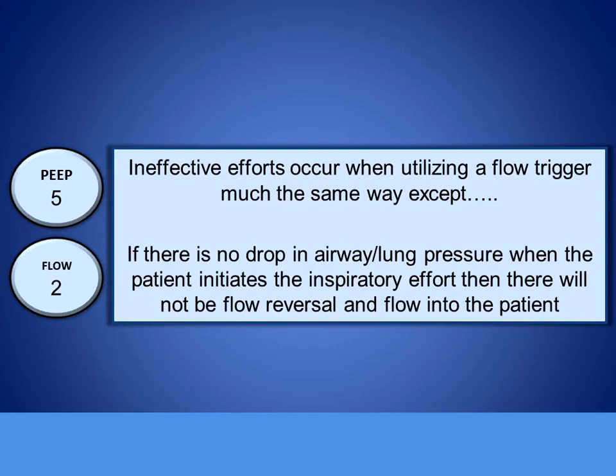My patients never will have ineffective efforts because I use the flow trigger. And I usually use a pressure trigger just to set up and kind of explain what's going on.